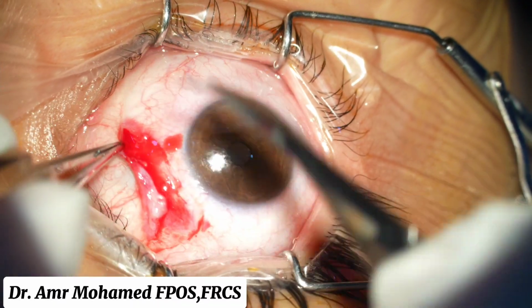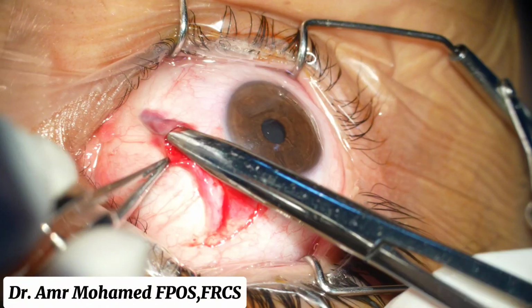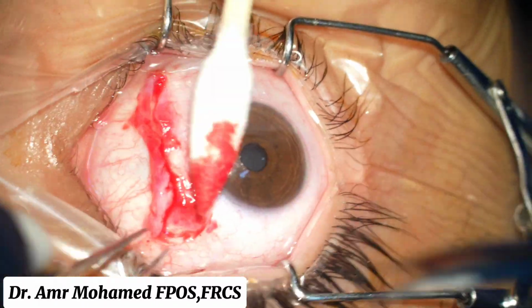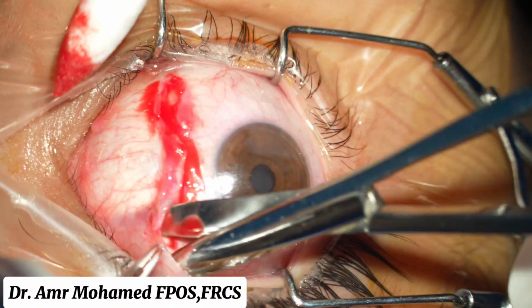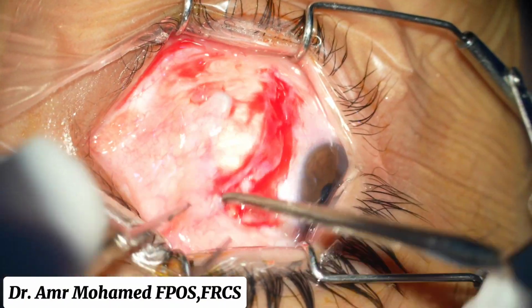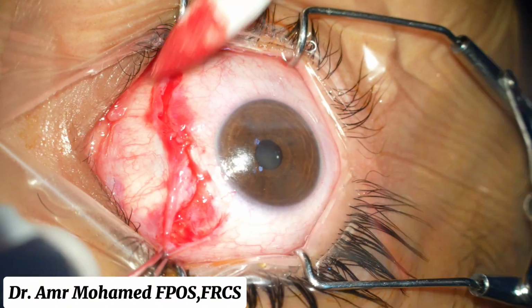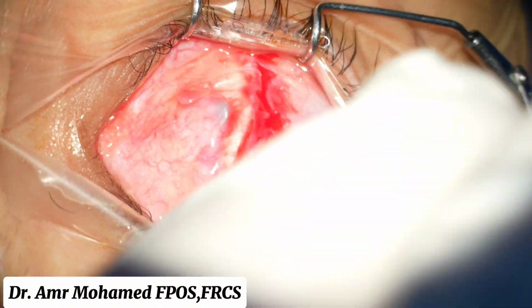So in such cases we might need to do a larger opening to be able to reach and hook the muscle. Actually, that part of the surgery might need half of the time. That very simple step usually will not take more than 1 or 2 minutes, but in re-surgeries it would take more time to do proper dissection and be able to reach the muscle.